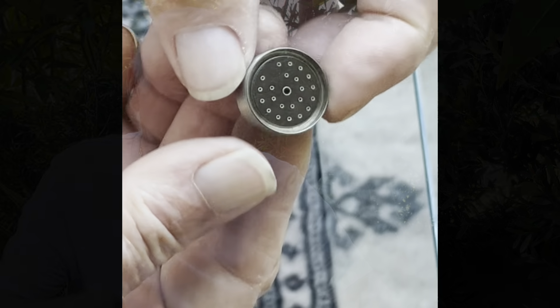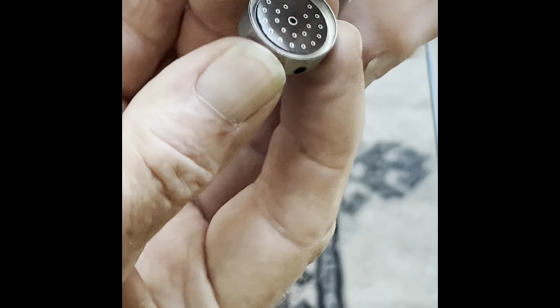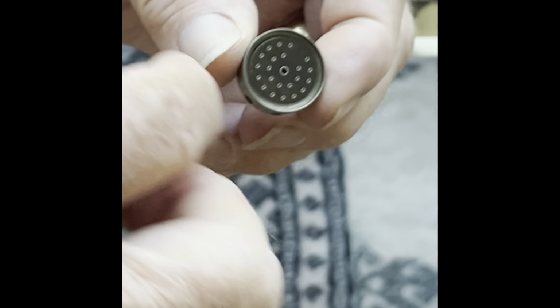But then the next problem was they needed to weld it. So another guy and myself, who did electronics for pacemakers while I did mechanical, between us we made a vacuum TIG welder. And this welder, when they pressed it, had all the electronics in, everything was connected. We put this little thing in the welder, and it just ran a weld all around it, sealed it perfectly.